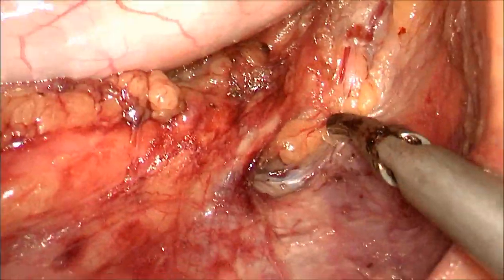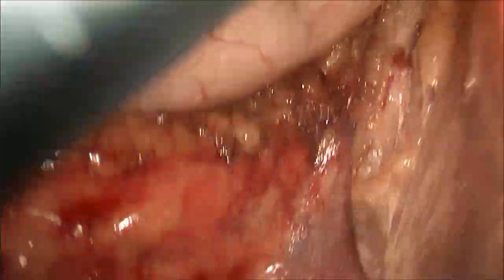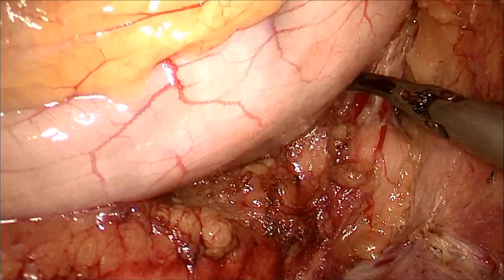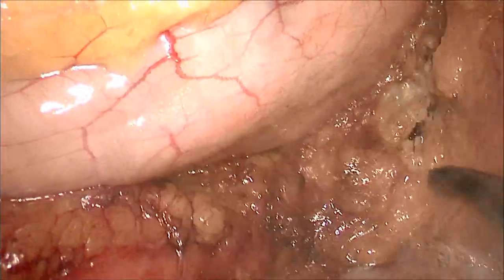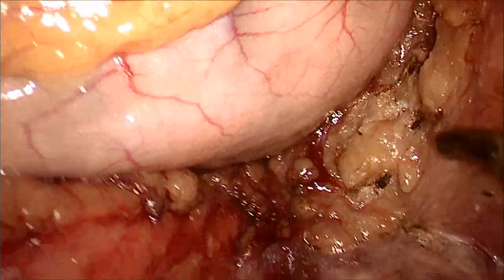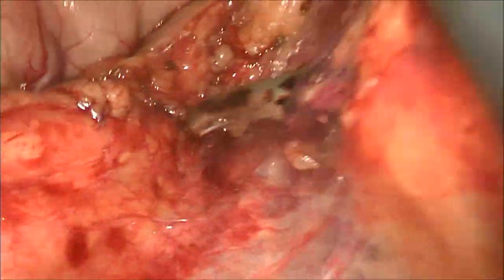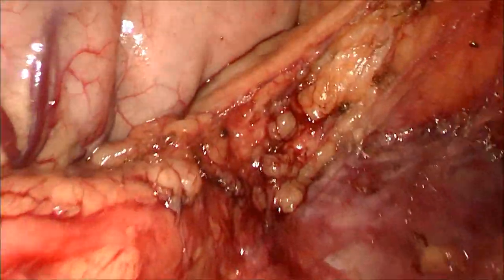At the splenic flexure, sometimes the tail of the pancreas may reach till the splenic hilum and may get lifted up during traction. Here, it is very important to avoid any injury to the tail of the pancreas. That completes the medial to lateral dissection.